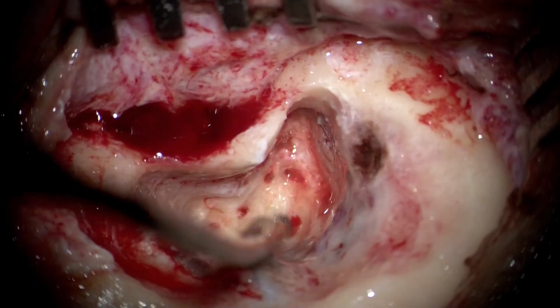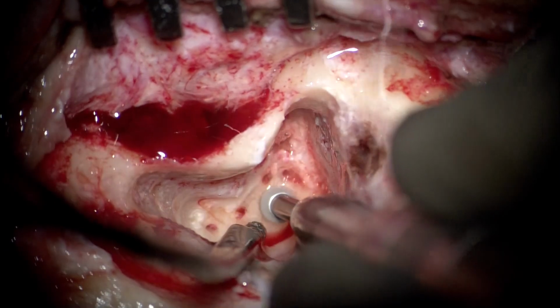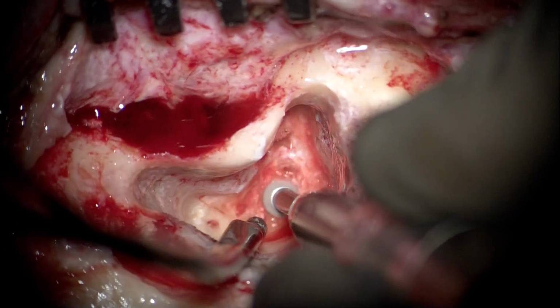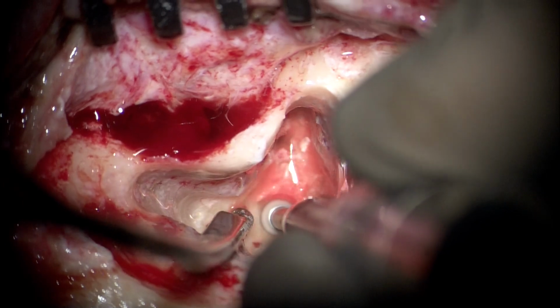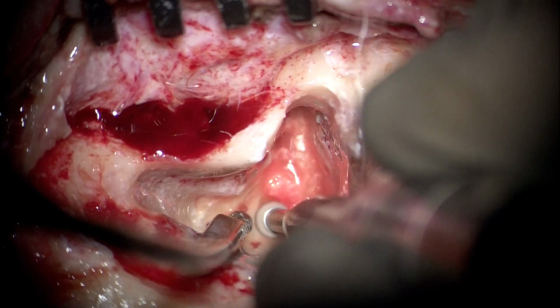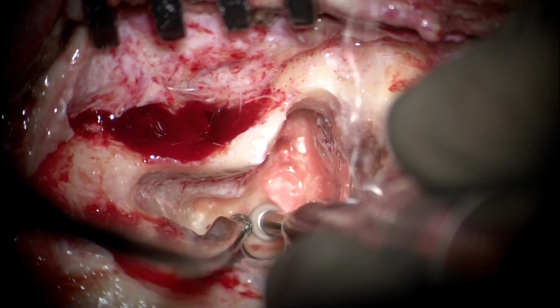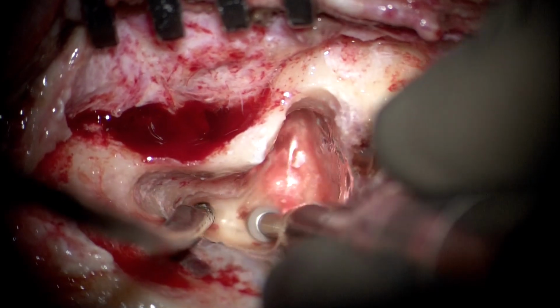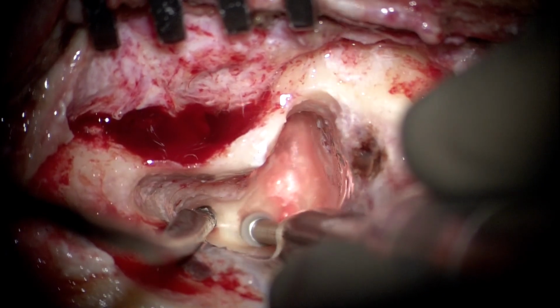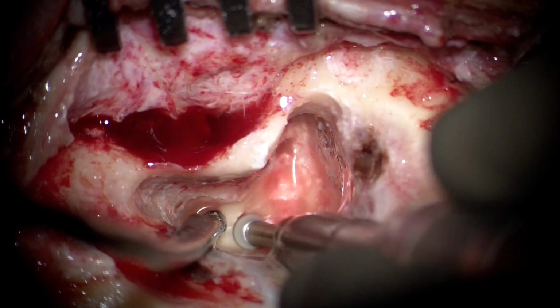With respect to our drilling, one can easily understand how important it is to generously decompress the sinodural angle and the posterior fossa bone plate, because otherwise this kind of exposure of the labyrinth is virtually not possible, much more so in a limitedly pneumatized or a sclerosed mastoid.